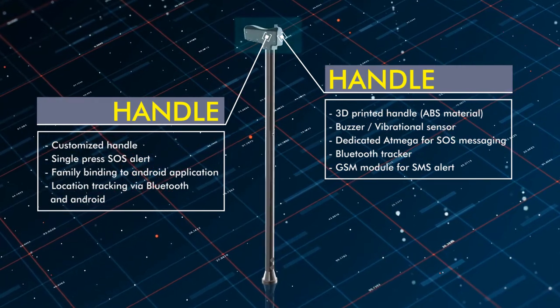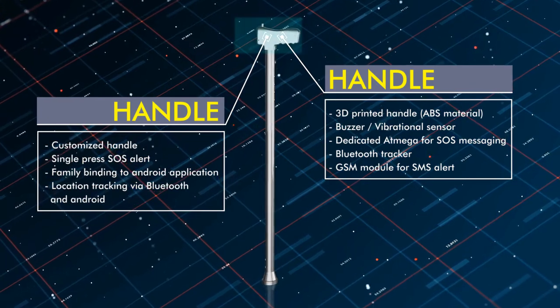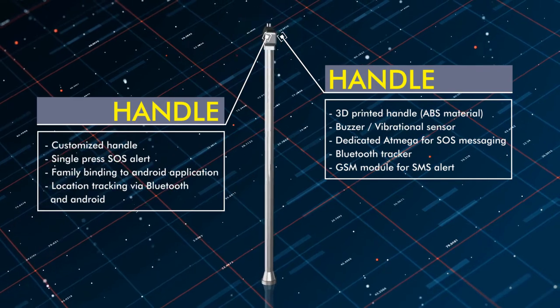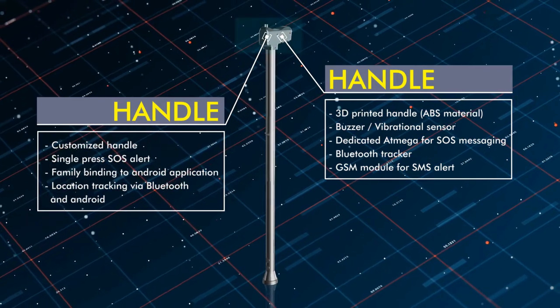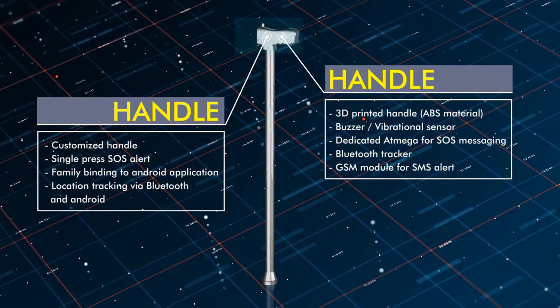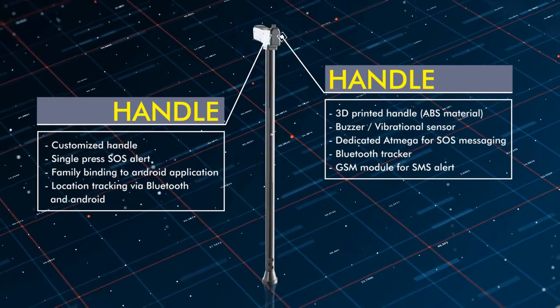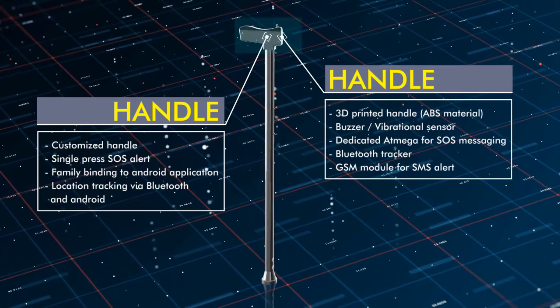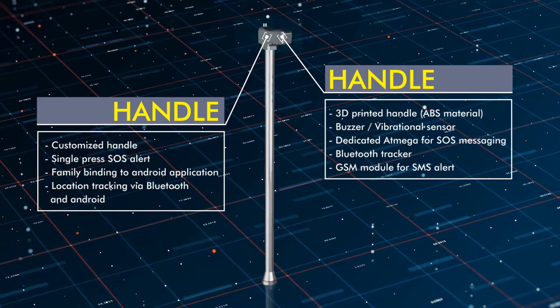The handle also has a power supply for a GSM module provided with a SIM card to send SMS alerts to intended people or people in contact with the user. The GSM module supports multiple contact numbers, and a separate Arduino Mega controller is dedicated for SMS messaging, considering safety as a primary factor.